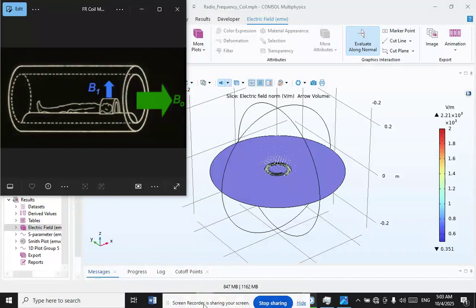Surface coils make poor transmission coils because they have poor RF homogeneity even over their region of interest. Their small field of view makes them ideal as receivers, as they only detect noise from the region of interest.